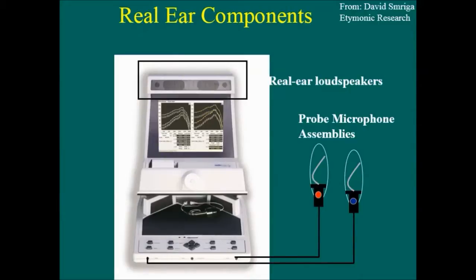The fitting method is chosen, and the computer is doing its number crunching, and then it's programming the hearing aid to recognize your hearing levels, apply the fitting method to your hearing levels, apply all the little tweaks and added digital algorithms, and then you hit save. And that's saved as program 1.